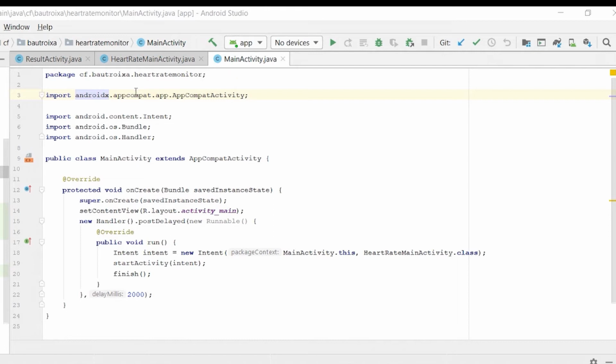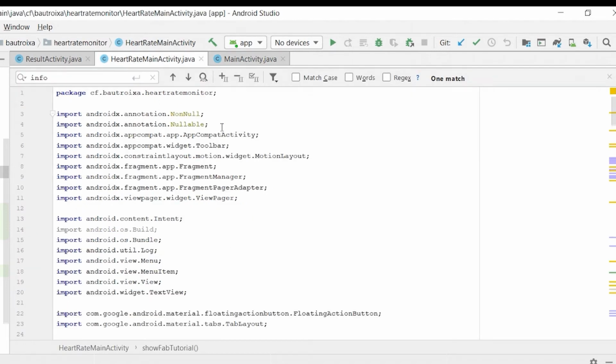In the main activity Java, we can see the packages are imported at the beginning, and from this we can link or move to the different classes as we run the function and start the new activity, moving on to the heart rate activity.java class. Now, let's take a look at the heart rate activity.java.